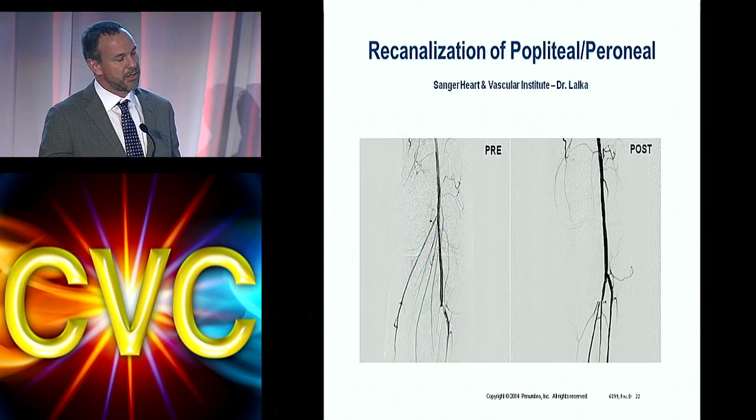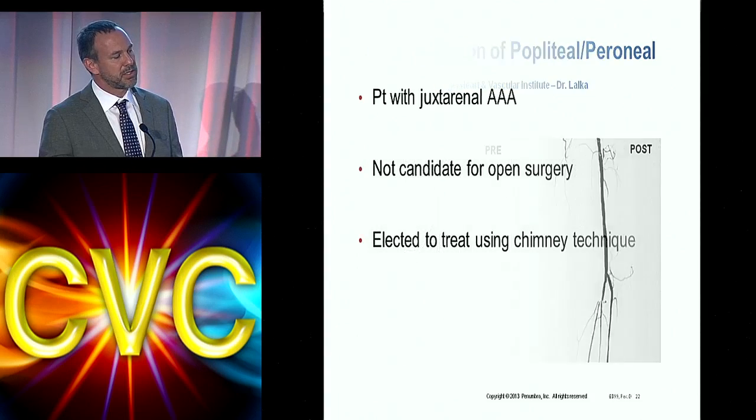This is a patient of my partner's. Patient came again with an acutely ischemic leg. You can see here not much in the way of flow going down into the tibial vessels. I was able to actually suck that out, and the patient did quite well.